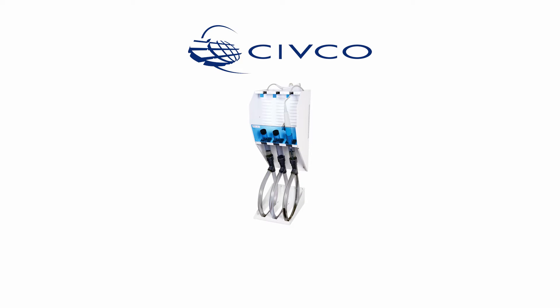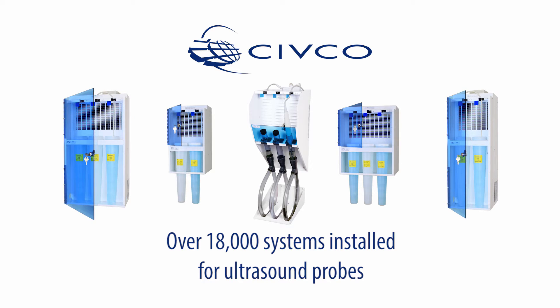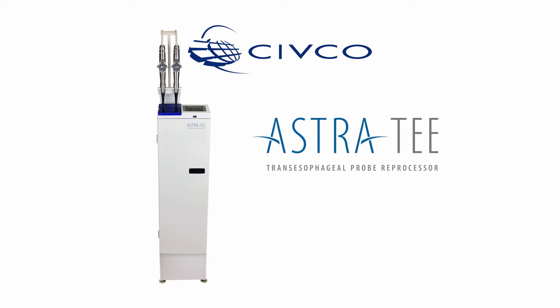For over 20 years, GUS Disinfection Soak Stations have been the leading manual high-level disinfection systems for ultrasound probes. Civco Medical Solutions is excited to introduce the latest in automated ultrasound probe reprocessing, the Astra TEE.